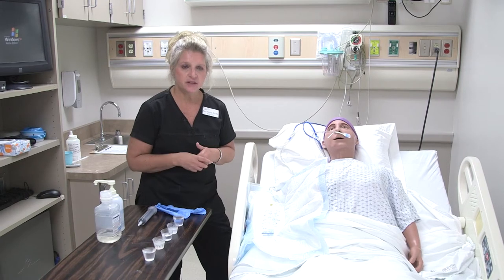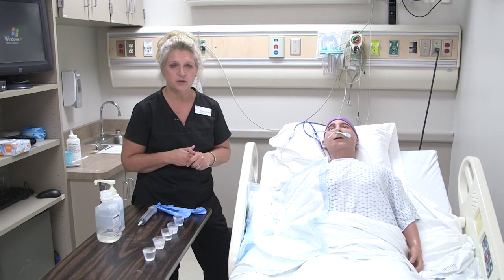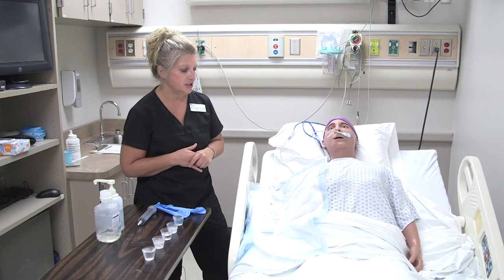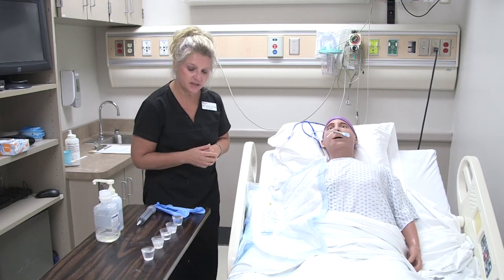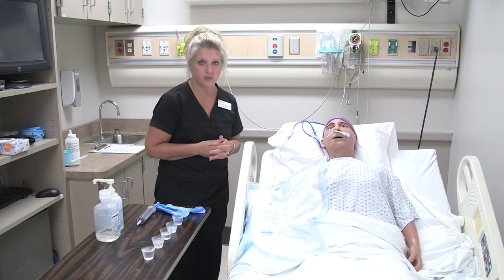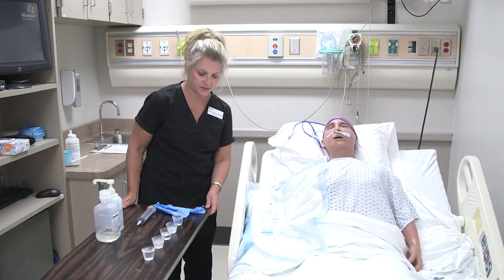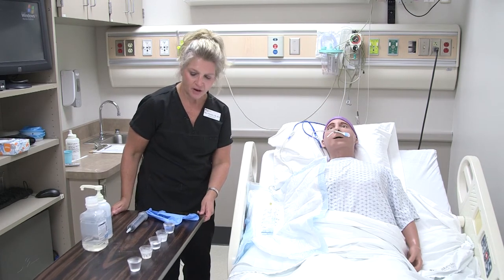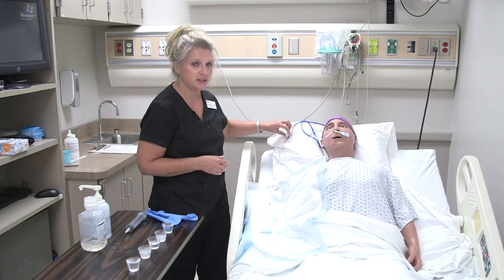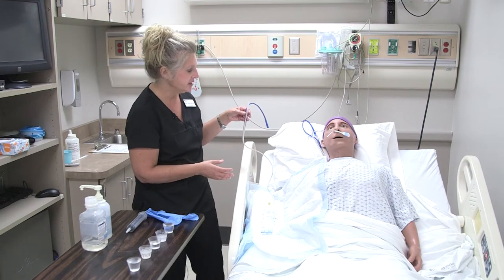I'm giving acetaminophen, so that requires me to ask the patient if they're having pain and do my pain assessment. If the acetaminophen is being given for a fever, that would be the assessment you want to do before giving it. Then you want to do post-assessments to follow up. Now I'm going to go ahead and make sure the tube is patent so I can administer medications through it.